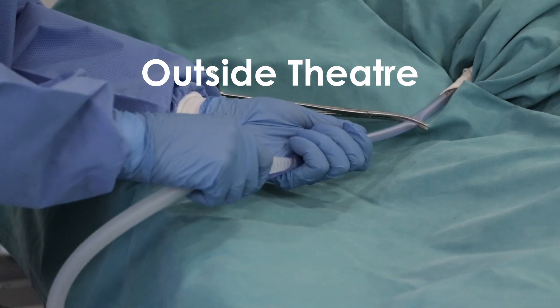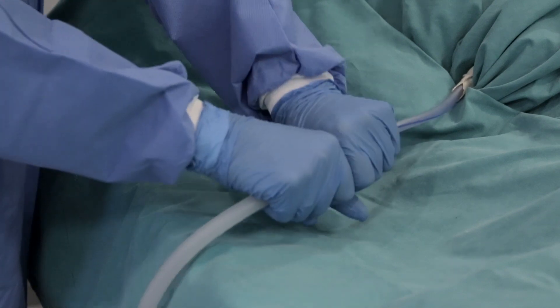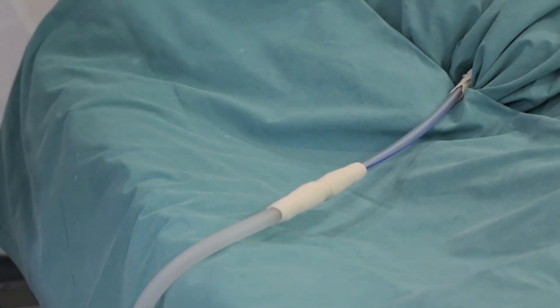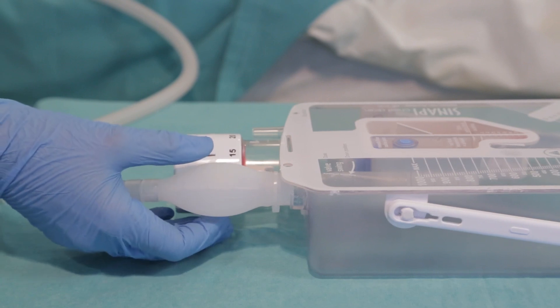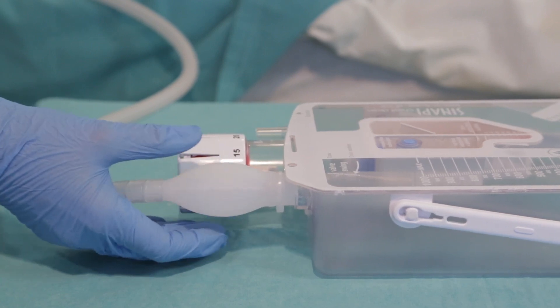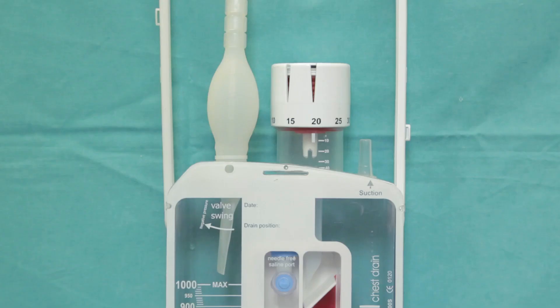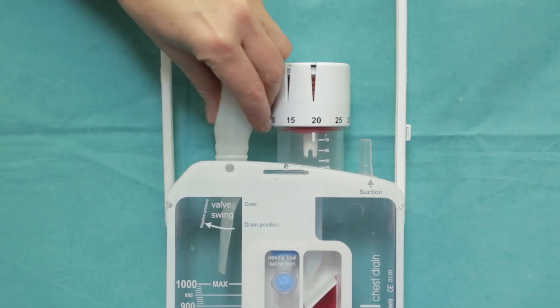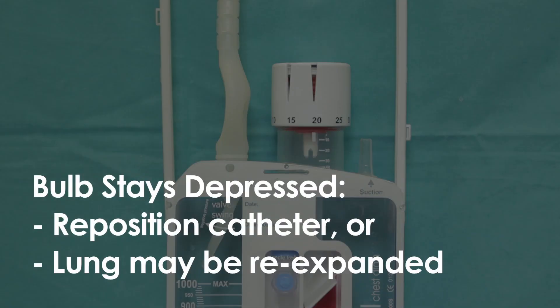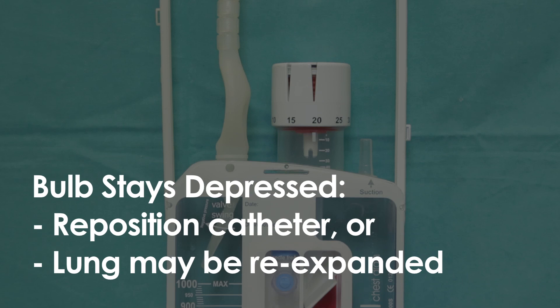When the chest catheter is inserted out of theatre, confirm its position as follows. Once the chest catheter is connected to the Synapi chest drain, depress the bulb. The bulb must initially re-expand, confirming that air or fluid is draining from the pleural space. If it does not re-expand, there is an absence of fluid or air at the catheter tip and the catheter must be repositioned, or the lung may be re-expanded.